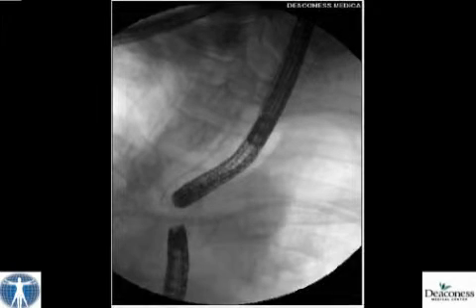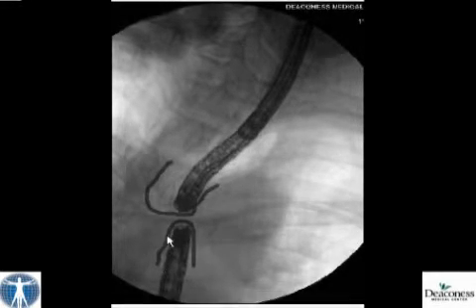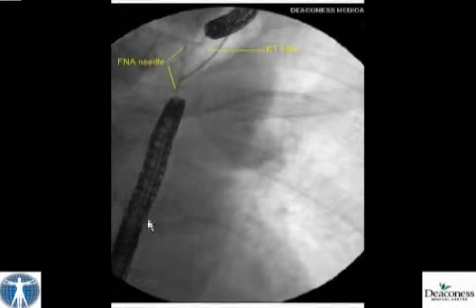This sequence of fluoroscopy images shows both endoscopes in place. Unfortunately, trans-illumination was not possible, and the puncture had to be performed solely under fluoroscopic control. Anatomically, the marked dilation of the upper esophagus compared to a more funnel-like aspect of the lower esophagus was helpful in constraining the approach from below in such a fashion that a successful puncture through several centimeters of fibrous tissue appeared feasible. Nevertheless, considerable force was required to accomplish this.